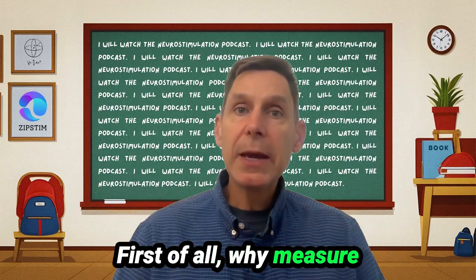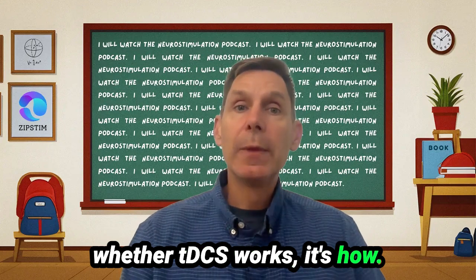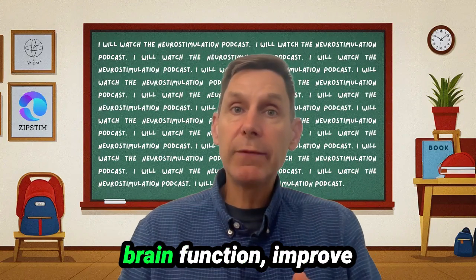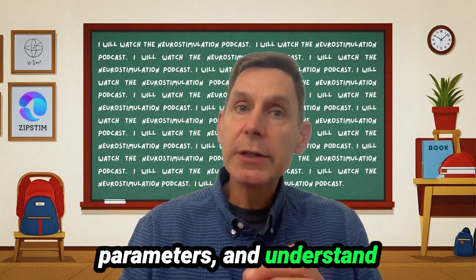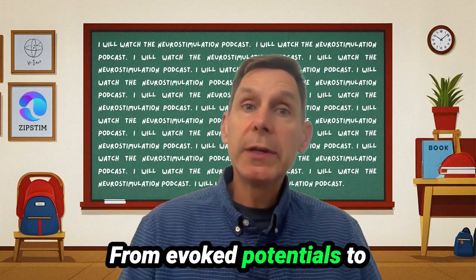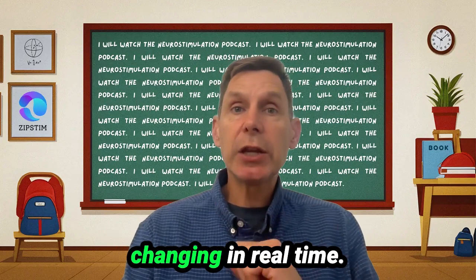First of all, why measure neurophysiological outcomes? The big question isn't just whether tDCS works, it's how. So to answer that, we need physiological measures. These allow us to quantify how stimulation affects brain function, improve stimulation targeting and parameters, and understand how brain plasticity is shaped and how it can be modulated non-invasively. From evoked potentials to functional MRI, modern neuroscience gives us the tools to peek under the hood and see what's changing in real time.